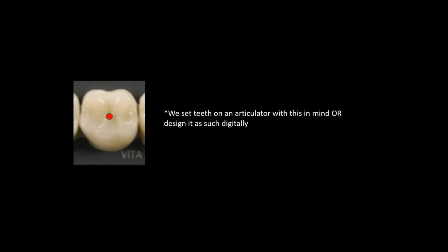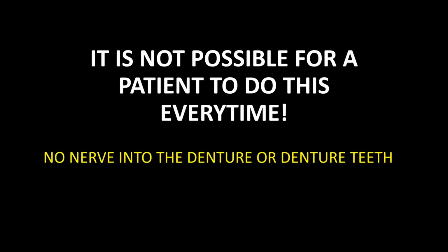Sorry, everyone, my dear colleagues, that was an aha moment for me when I realized, wait a minute, they can't feel their teeth touch, yet I'm trying to bullseye land centric here. And how are they going to reproduce that out in the real world? So we have to keep that in mind. So that led me down my journey and my trying to understand that, okay, that's not possible to do.